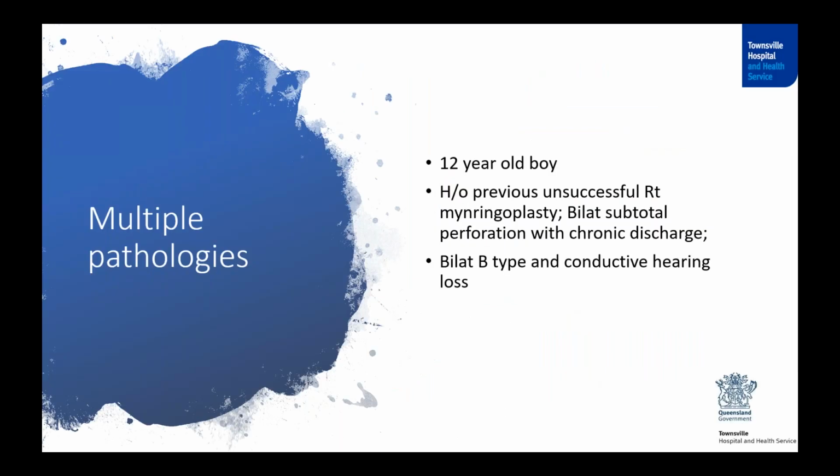Now, with the tympanogram, one of the limitations is that when there are multiple pathologies, you won't be able to differentiate between them based upon the tympanogram pattern, whereas wideband absorbance can throw some light if there are multiple pathologies.